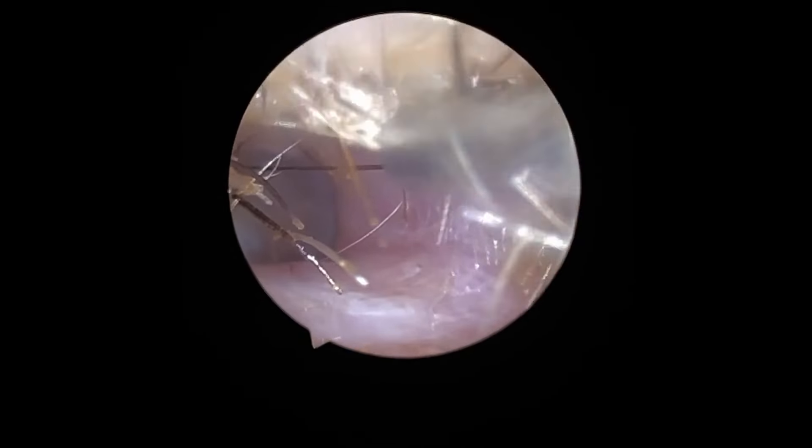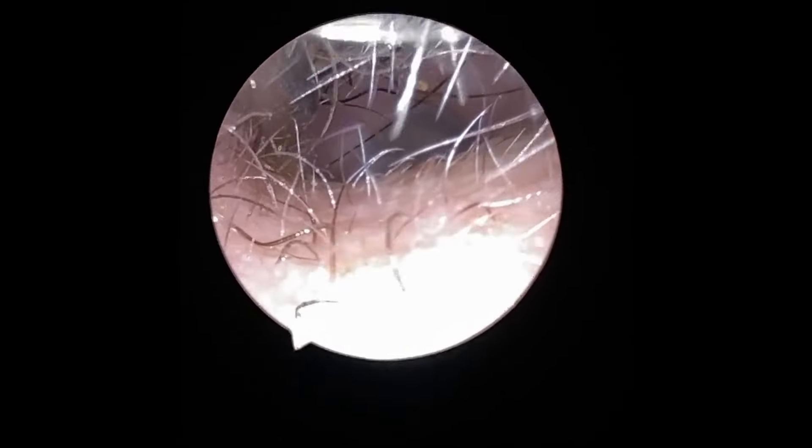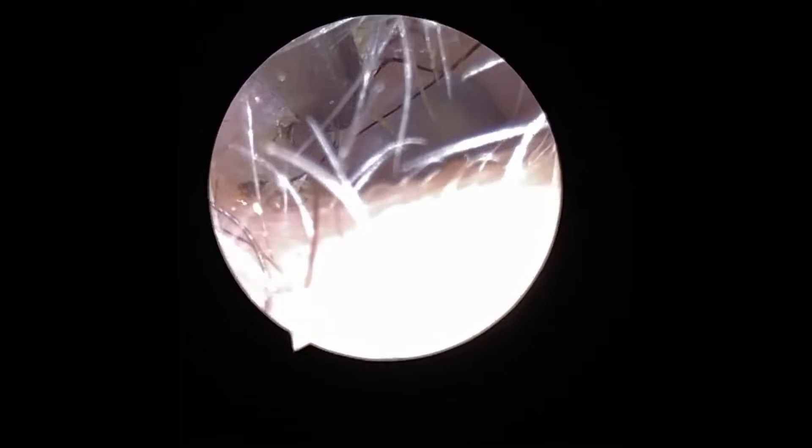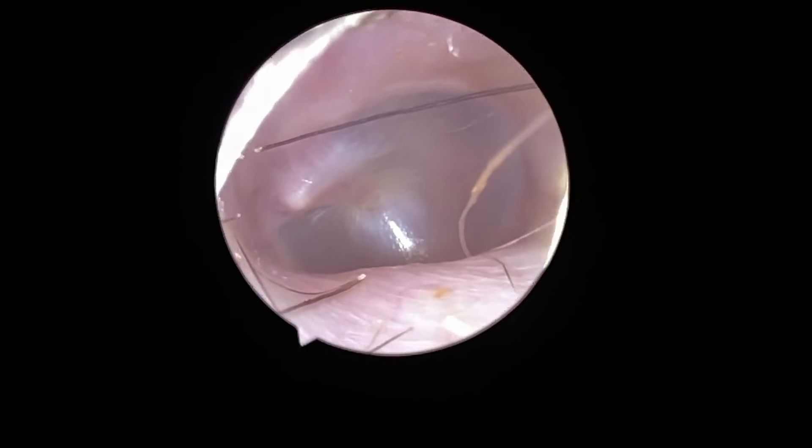I'm taking my time to check everything around the periphery to ensure that every piece that is ready to come off will do. A small skin piece lifting up here, followed by some more of the peripheral keratin. Here is a final shot of the eardrum — quite a beautiful looking eardrum and very clear once I get the endoscope through the hairs.